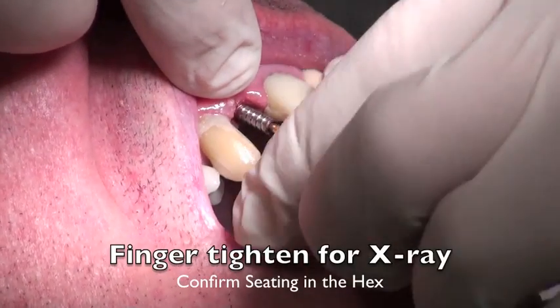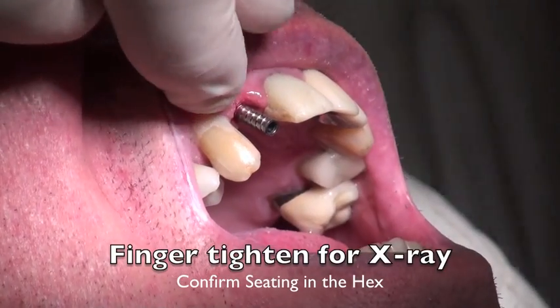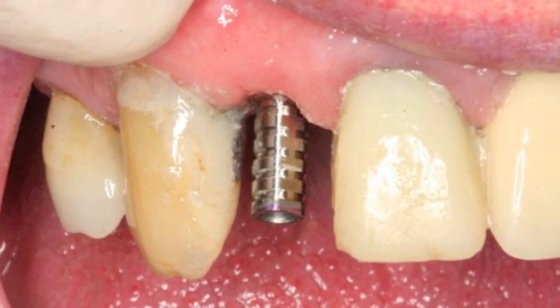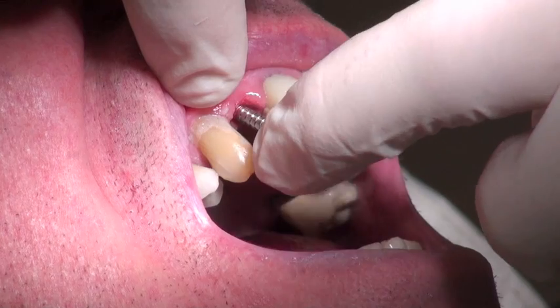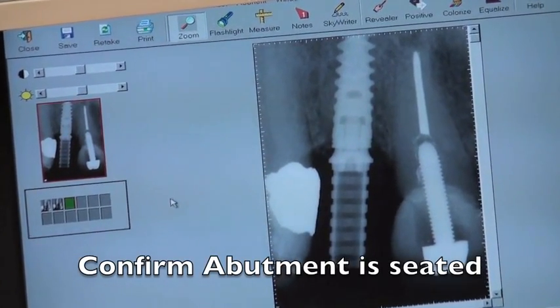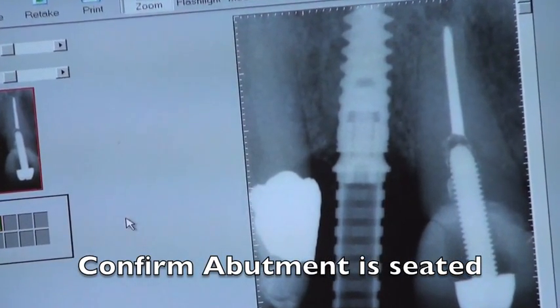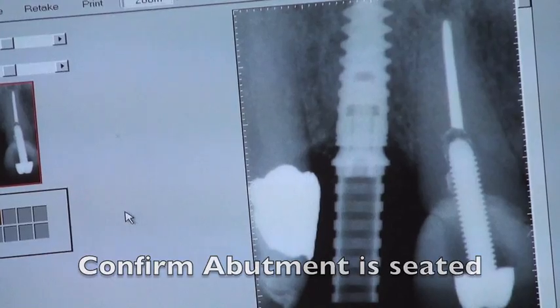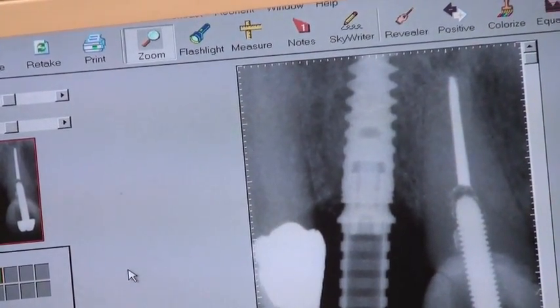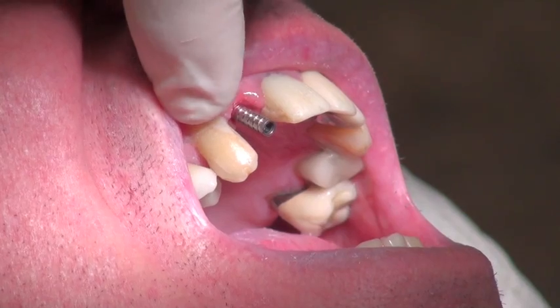Here we are doing this — you can see that we're rotating this down into the hex. We want to engage the hex and make sure that this temporary cylinder is in that hex before we proceed to the next step. We take an x-ray to confirm that this is actually the case, and we can see that the cylinder is fully seated. Now once this is fully seated, we're able to go on to the next step, which is to start to make the temporary crown.